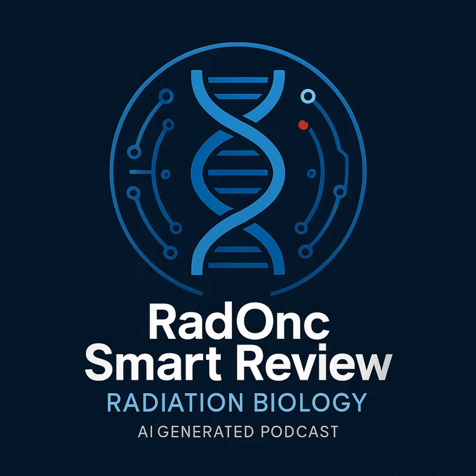And then there's one that can be a bit tricky because people usually think MRI. Yes, gadolinium, Gd. Primarily an MRI agent, absolutely, but because it also has a high atomic number, it does provide CT contrast. That's a classic board point. Definitely remember that one. Gadolinium for CT too.